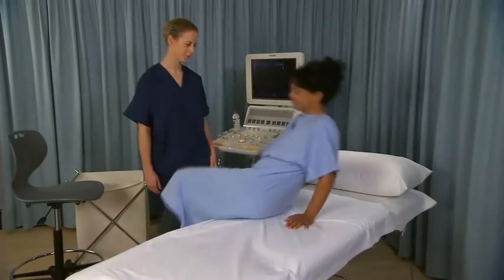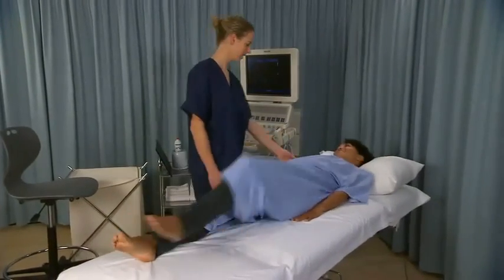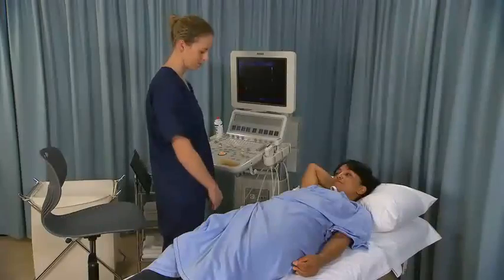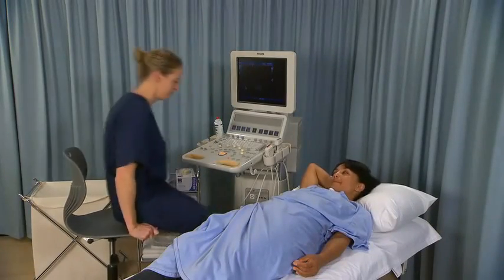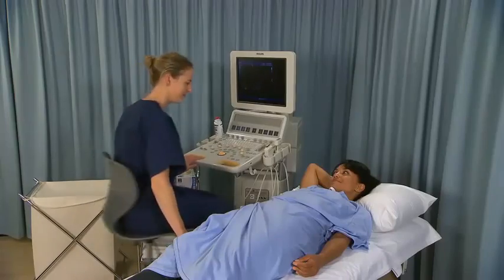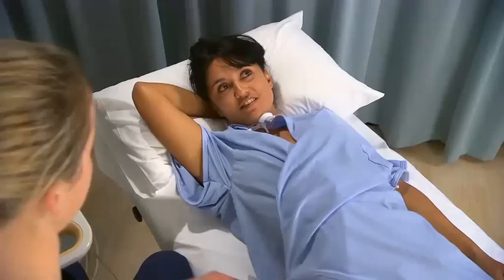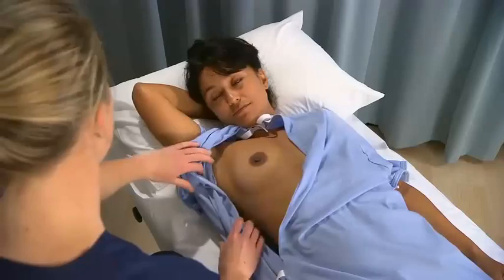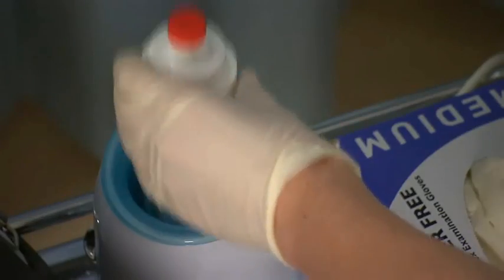Ask the patient to lie supine on the examination table and raise the ipsilateral arm above her head. Sit or stand on the patient's right hand side with the ultrasound machine to the left upper end of the table. Expose the chest and axilla on the affected side and apply acoustic gel.